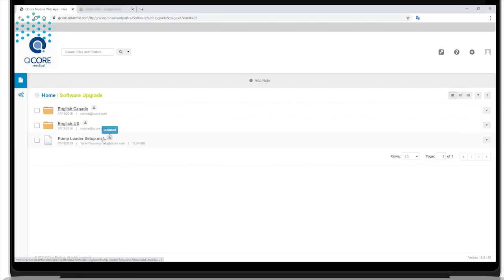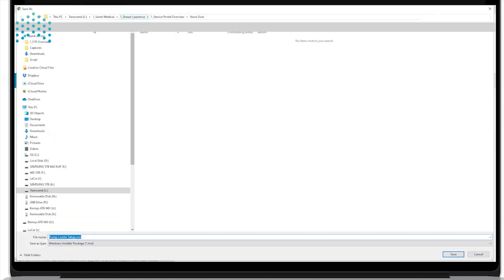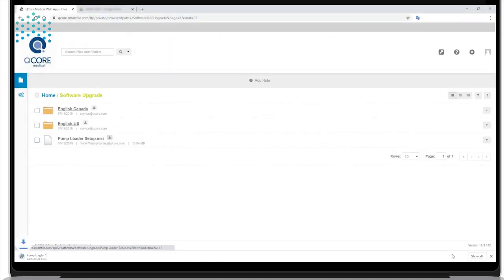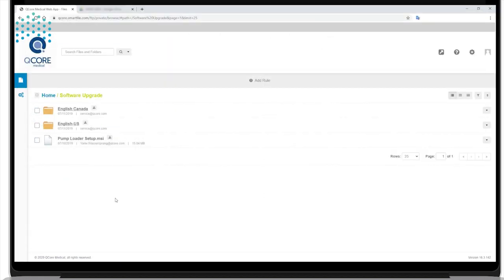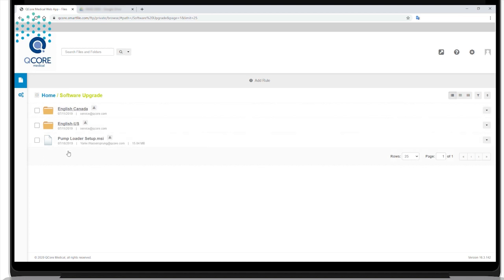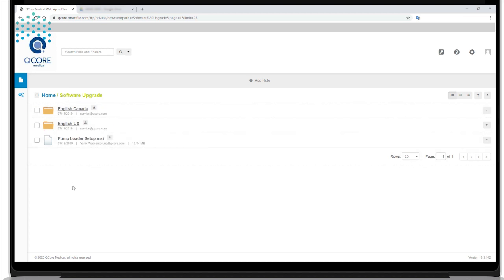Download the software upgrade folder from the FTP site. The folder includes the pump loader setup file and the available Sapphire software revisions for your region.